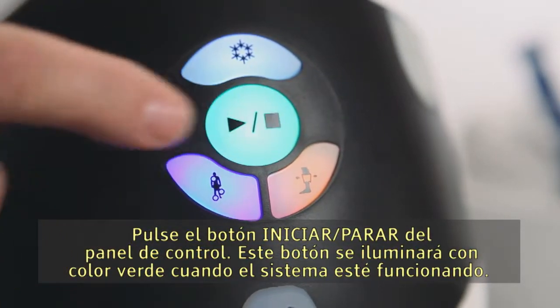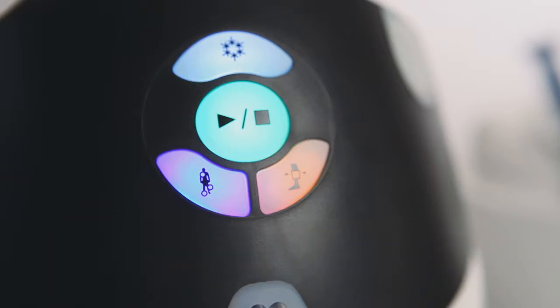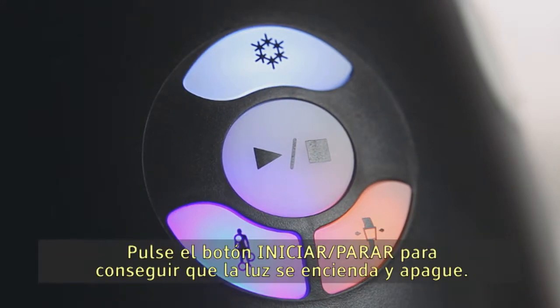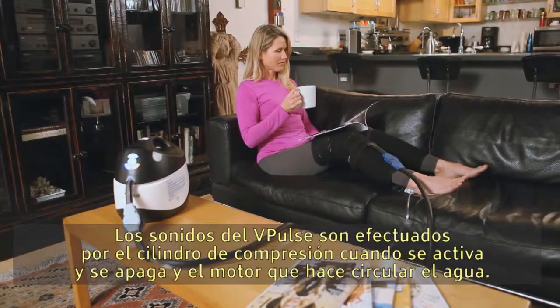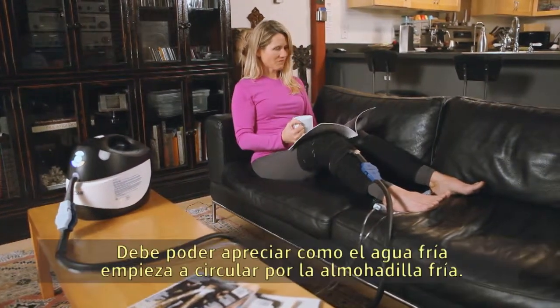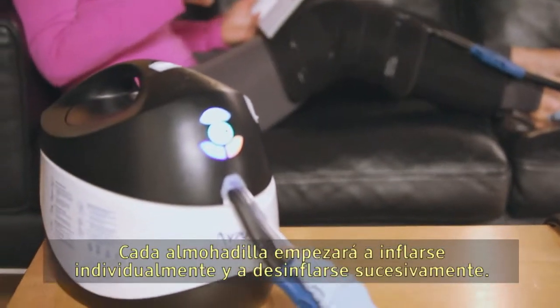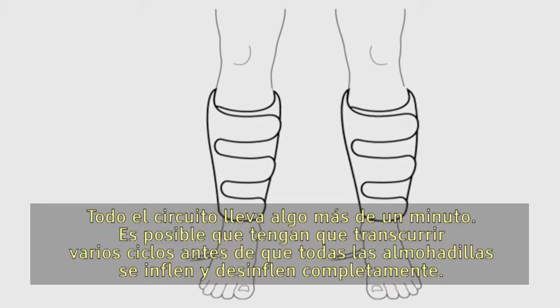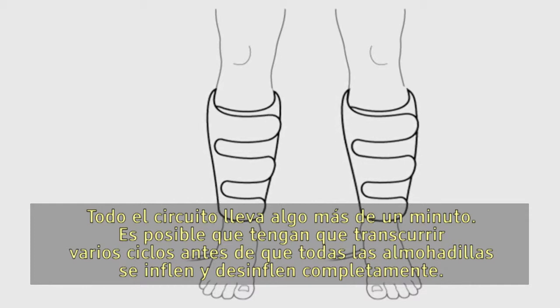Press the start/stop button on the control panel — this button will illuminate green when the system is running. You can change the settings only when the system is stopped. The sounds from the V-Pulse are the compression cylinder cycling off and on and the motor circulating the water. You should feel the cold water begin to circulate in the cold pad. Each pad will begin individually inflating and deflating in succession — the entire circuit takes a little over a minute. It may take several cycles before all pads are fully inflating and deflating.